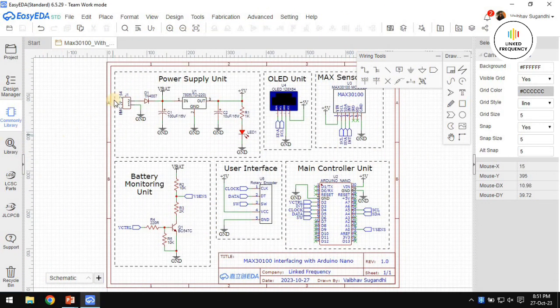Alright, now you can see that this is how the schematic of our first project, which is all about interfacing the MAX30100 module with the Arduino Nano development board, looks. Here we have added one small diode for protection with the battery. This is an RMC connector for the battery itself. We are connecting a battery here directly. A two-series connected battery pack will be connected here, and this diode protects the entire electronic circuit from the reverse connection of the battery.